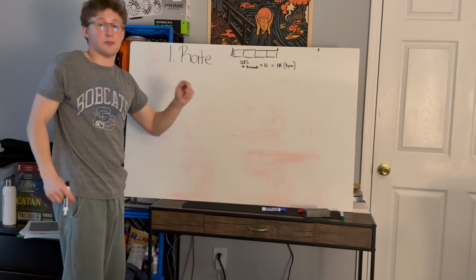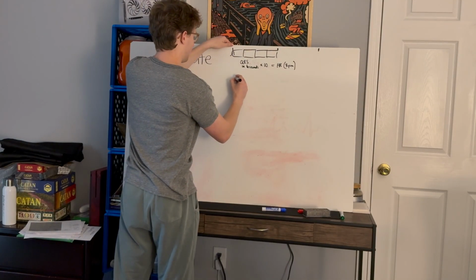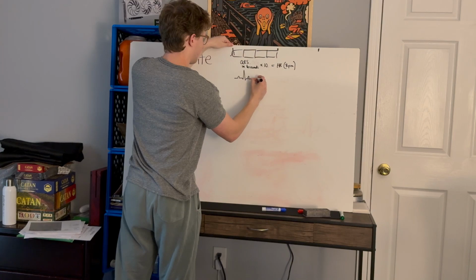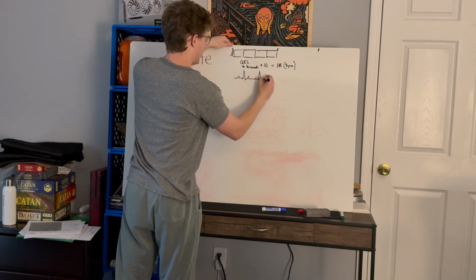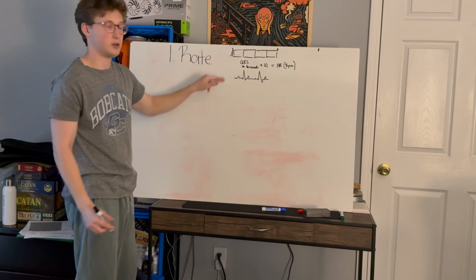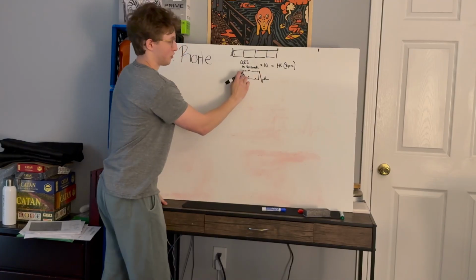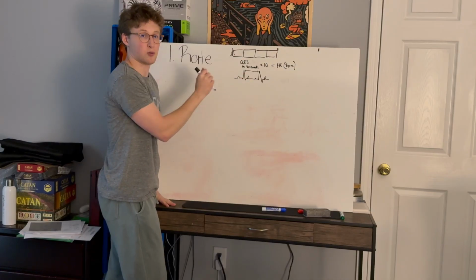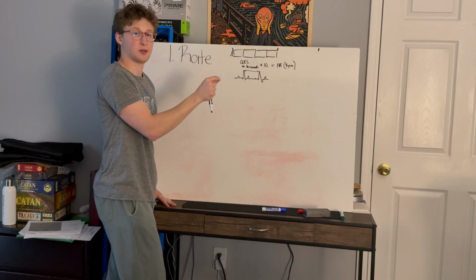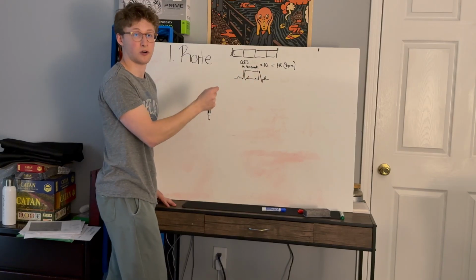That's number one. Number two is, imagine there's big boxes, small boxes here, but what you do is you look at the distance between these two QRS complexes. And remember earlier, this upward deflection is actually the R part of the QRS complex. So when you're measuring between one QRS and the other, it's called an R to R interval.